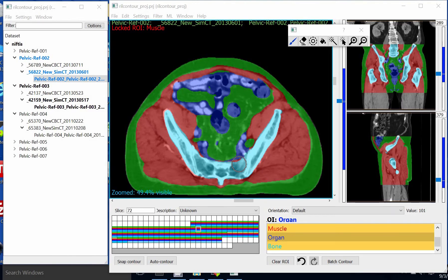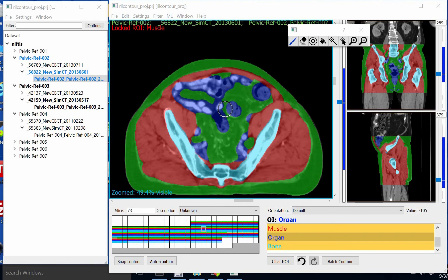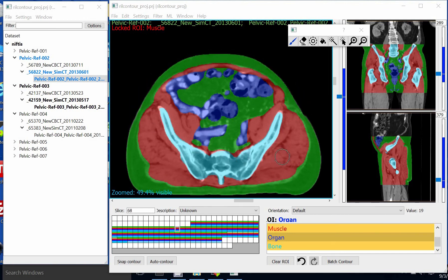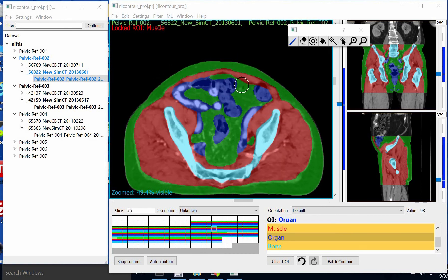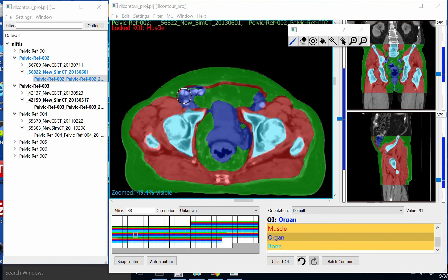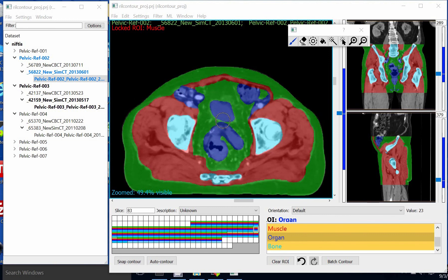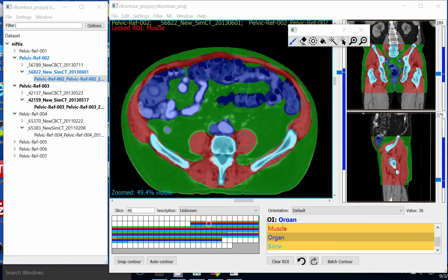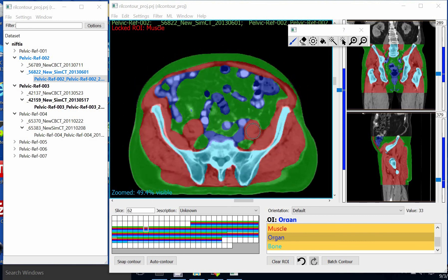We finished correcting all of the organ in this scan. It can be a little tricky to differentiate between what we're defining as organ and muscle — they have about the same brightness. In this patient it's a little easier because they've had oral contrast, which shows up brightly in the intestines. The general rule is that the muscle forms a well-defined abdomen compartment, and then on the backside it's the posterior muscles of the leg. Basically everything inside this compartment is going to be blue, with an exception for some vessels that pass through this wall lower down. The other exception is the psoas muscles, which are the structural muscles that help hold up your spine — they're easy to spot in the upper abdomen and you just trace them as they go down.